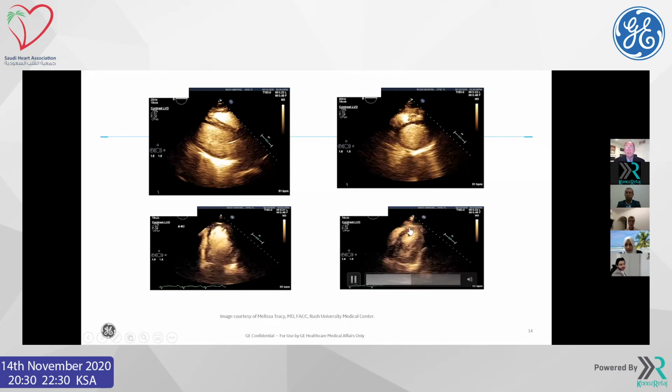But certainly here in this apical long axis, it looks very nice. Or maybe that even looks more like an apical 4 that's just been adjusted a little bit to bring it out. What I'm trying to say is, sometimes when we don't have the upper part of the epicardium of the apex, part of it has been taken up.